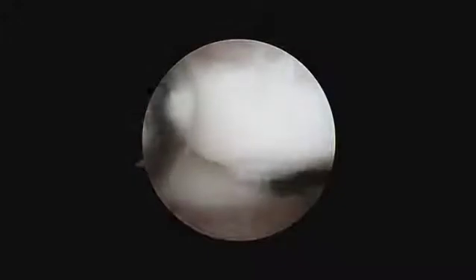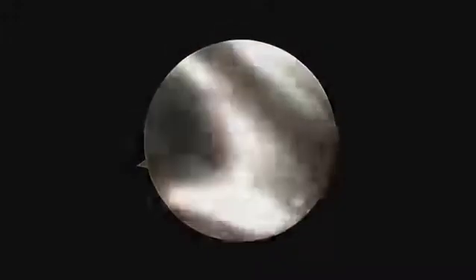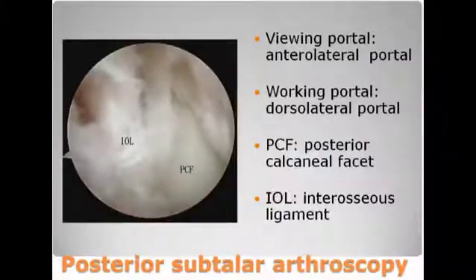Moreover, any inflamed synovium can also be resected through these portals. After completion of the debridement, the arthroscope is then gently retrieved until the sinus tarsi and the posterior subtalar joint can be seen.